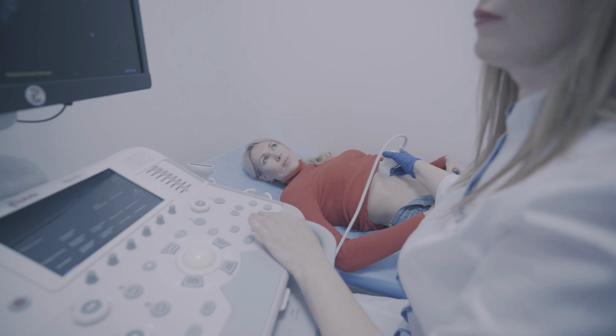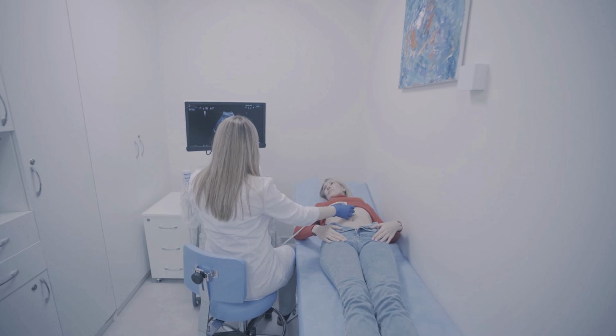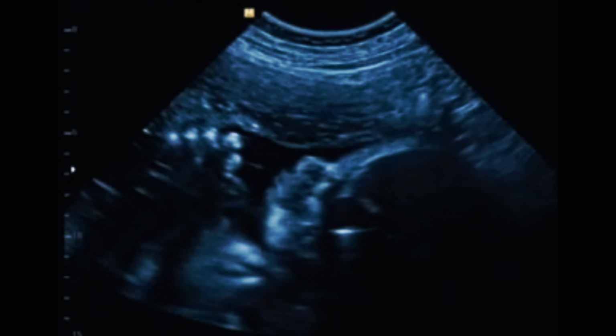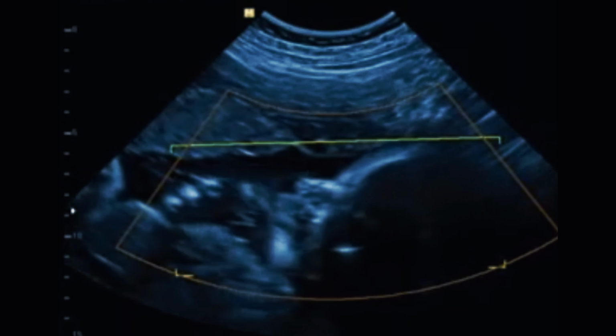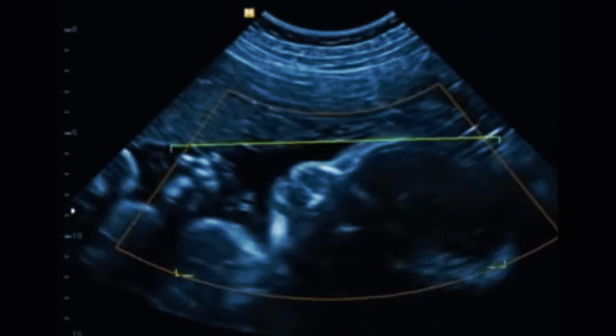Limitations of ultrasound. Limited penetration. Ultrasound waves cannot penetrate bone or gas-filled structures, making it less useful for imaging certain areas, e.g., lungs or intestines. Image quality. The quality of the image depends heavily on the operator's skill and the patient's body type, e.g., obesity can make imaging difficult. In summary, ultrasound machines are indispensable tools in modern medicine, offering a safe, non-invasive way to examine internal structures and guide various medical procedures. Advances in imaging technology continue to improve their diagnostic capabilities.